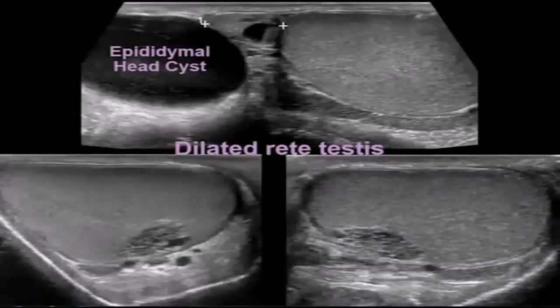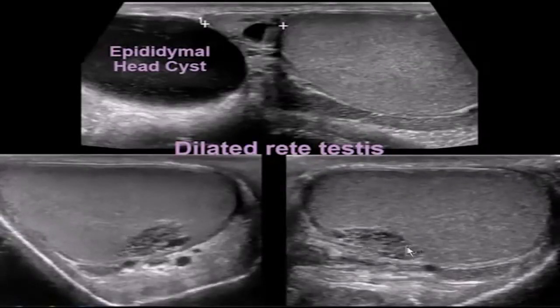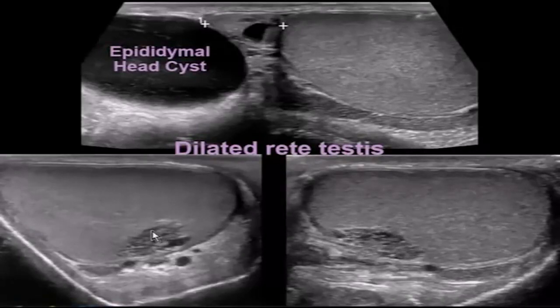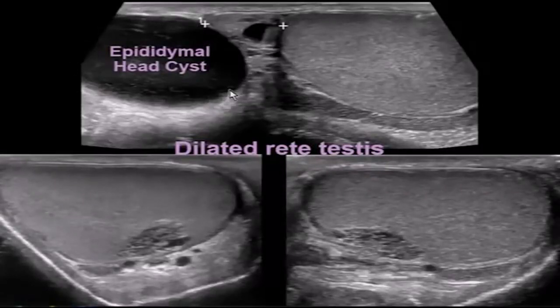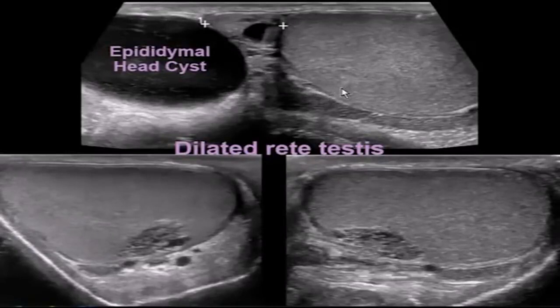This patient had dilated rete testis. You can see this irregularly shaped clump of cystic areas — dilated tubules at the mediastinum of the testis. This is most commonly seen in older patients and is very commonly associated with an epididymal head cyst, thought to occur as a result of obstruction in the epididymis leading to backup into the testicle with dilatation of the rete testis.